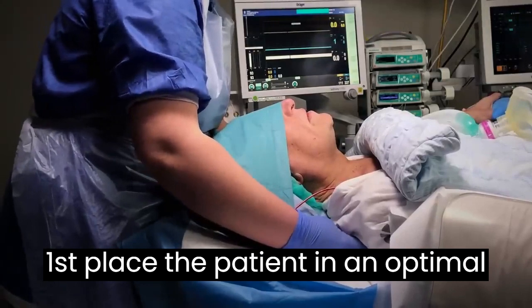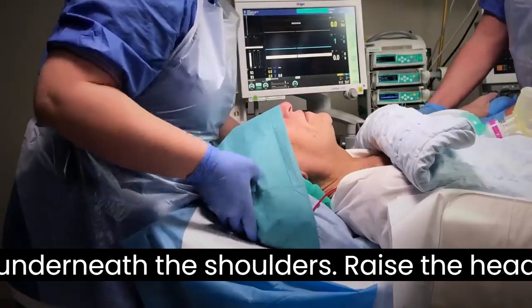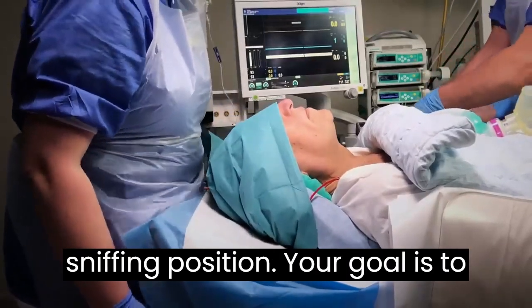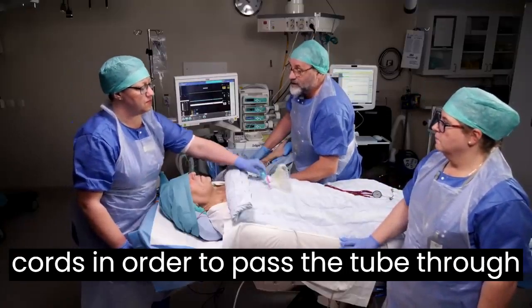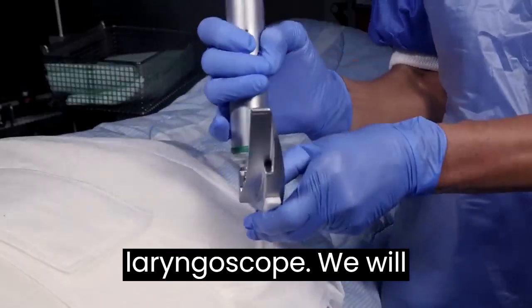First, place the patient in an optimal position with the pillow tucked underneath the shoulders. Raise the head relative to the body into the so-called sniffing position. Your goal is to achieve a line of sight to the vocal cords in order to pass the tube through them into the trachea. This requires a laryngoscope.